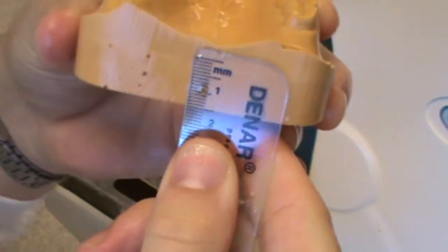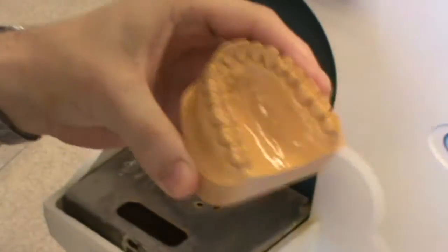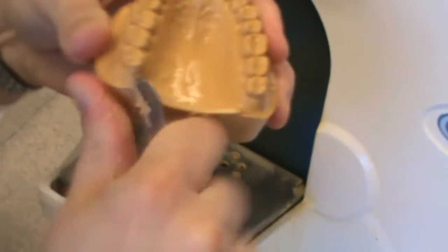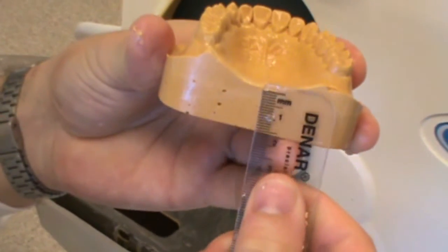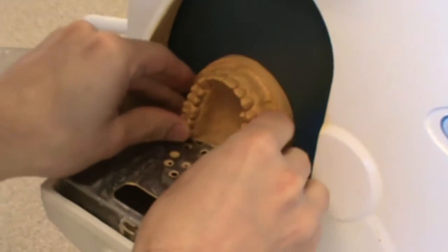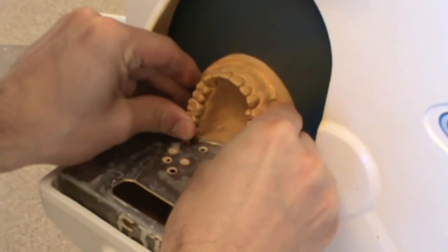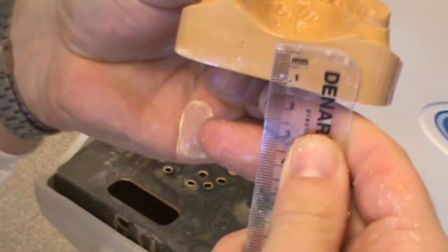When finished, I want the cast to be about 15mm thick in the thinnest area. In this case, I'm still a little bit thick — probably about 3 or 4mm over that 15mm. I need to determine why I'm thick. It looks like there's a little bit of a lip here that I'm going to carve with my knife — it's probably 2 or 3mm I can flatten out. I'm about a millimeter away now, about 16mm on the posterior aspect of my cast. Typically you want it to be about 15mm thick in the thinnest area, so in the palate area it may be around 12 or 13mm in the center.